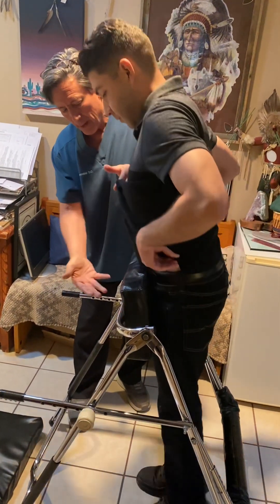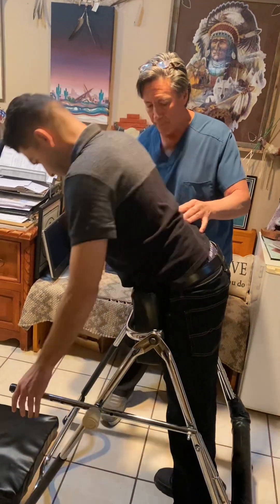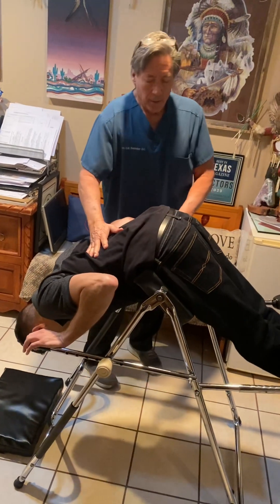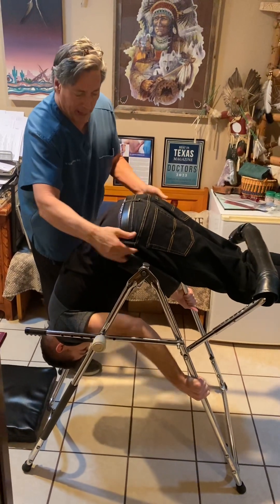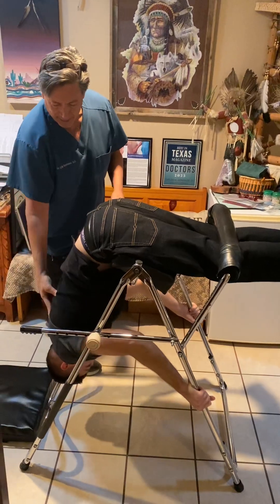Up on your tiptoes, get up as high as you can and flip for me. Now pull your — there you go. If this is not comfortable here, we need to pull the body out. You see how it dropped down even easier now?